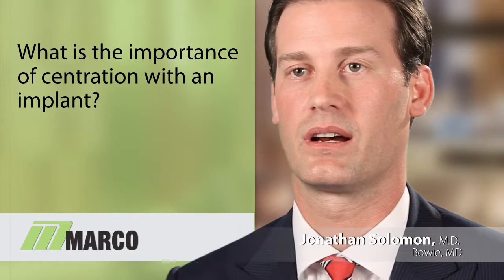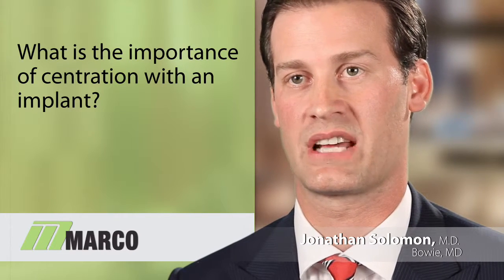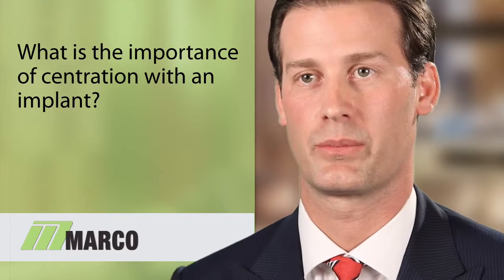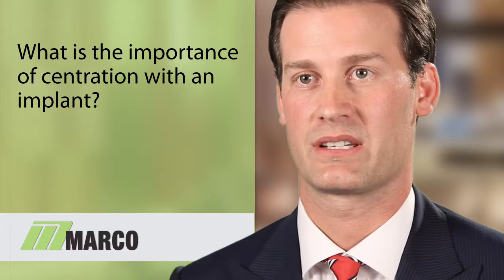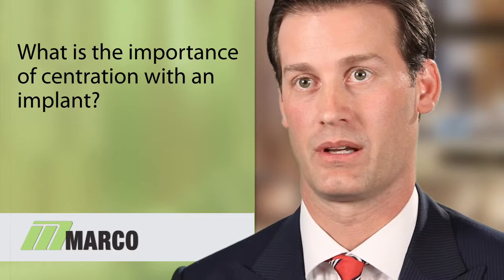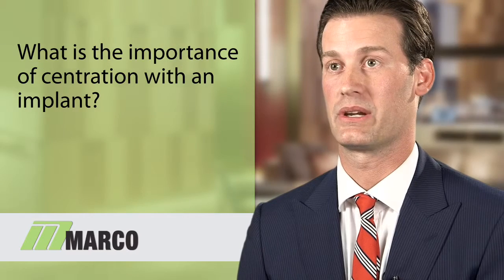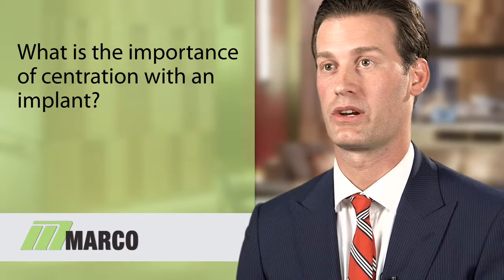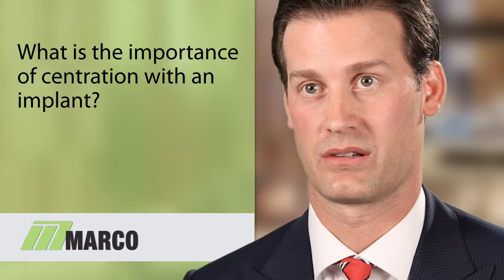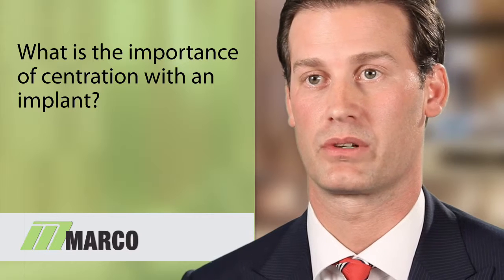The importance of centration with an implant is particularly key when you are leaning towards not only aspheric implants, but certainly multifocal implants. It is not uncommon to encounter a patient in your clinic who very well may have a significant discrepancy of line of sight, or what we sometimes call angle kappa, but more importantly call angle alpha. And that is something that is easily measured with the OPD-3. Numbers such as 0.3 or greater of angle kappa are one way of identifying a patient, just as they enter the door, that may not necessarily be a very good candidate for multifocal implants.